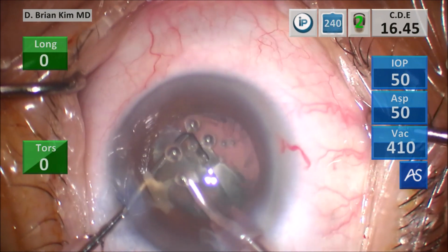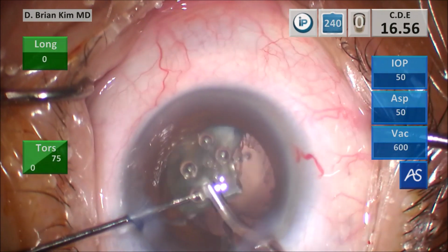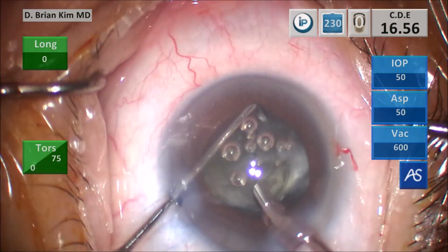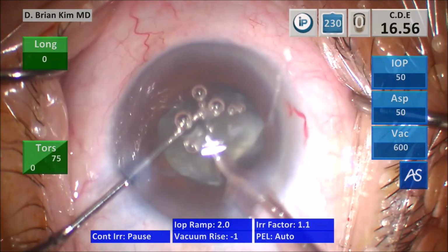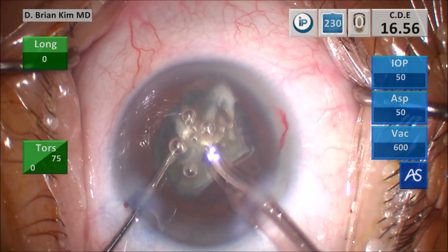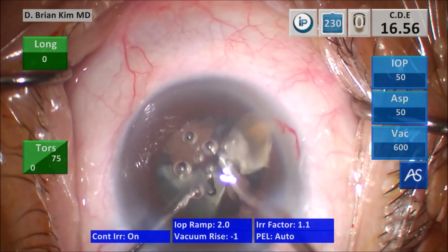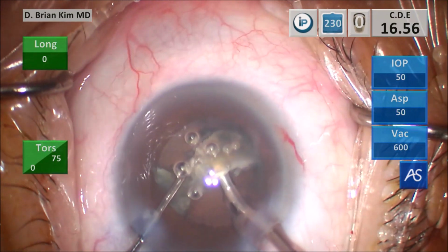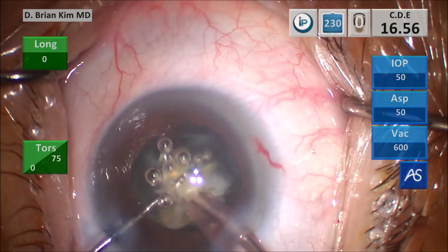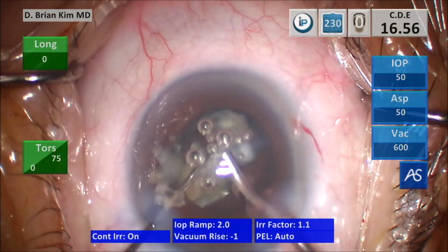And so this case just illustrates once again why double chop, cross chop mechanical fracturing techniques are just so good. Now, of course, you can do it other ways, and you probably get great results if you're an excellent surgeon in your own right. But the point of the matter is, if you're one of those guys that some days you have clear corneas, some days you don't, and you have a lot of edema, you really have to check your technique. Okay? Again, for those surgeons who are getting great results and doing it their own way, well, then they don't have to watch this video.